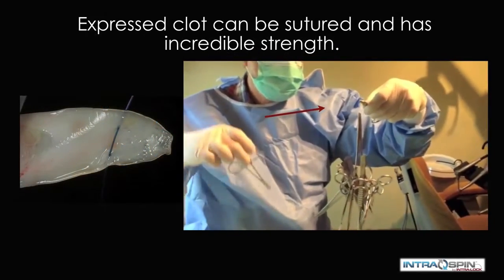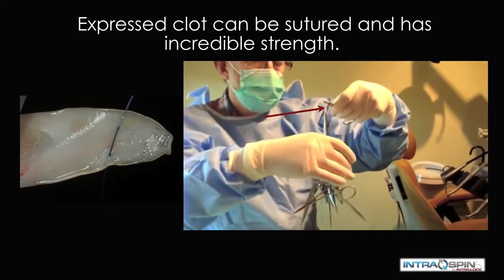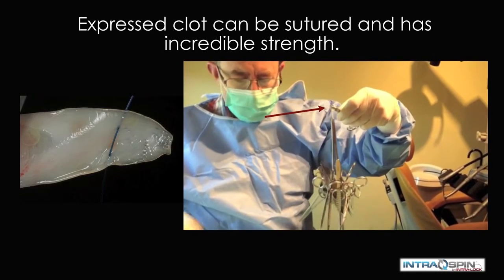In this video, we see a single fibrin membrane holding multiple heavy surgical instruments. This really speaks to the durability and strength of the PRF membrane. In fact, it can be sutured and it will not tear.